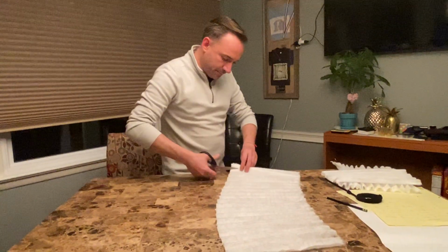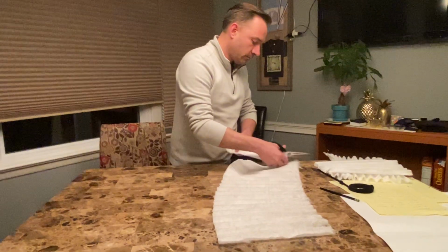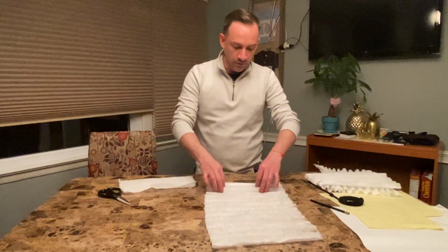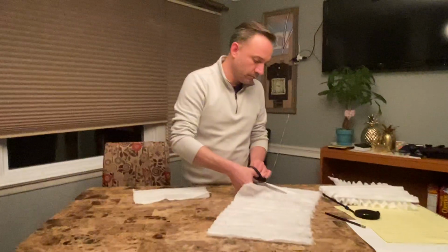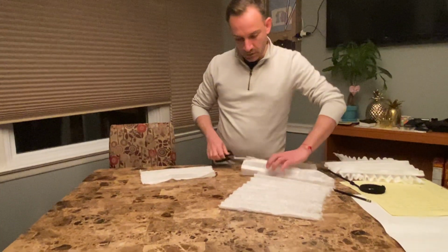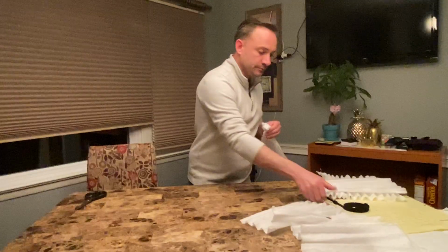And you cut it. So you can make a few masks with only one filter. So again, you do 1, 2, 3, 4, 5. You can make it the size you want, or you need. And then you cut it. And so on. Okay? After you cut it, you go to one side and you can tie it up.